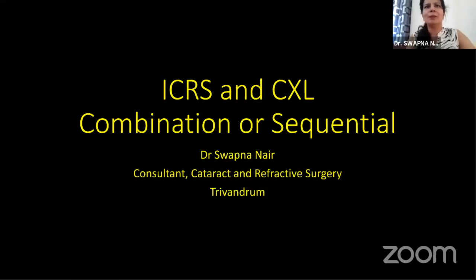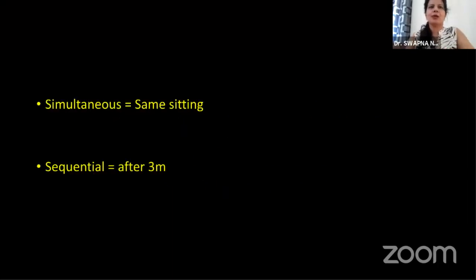I hope my screen is shared. So this has been a long raging debate, and there's nothing new in this particular debate. I'm just weighing the pros and cons of each, what the studies say, and what has been seen over the years. By simultaneous, we mean it happens during the same sitting, that is, you implant the intracorneal ring segment and this is followed by the collagen cross-linking, which can be accelerated or may follow the full Dresden protocol, or it may be epithelium-on cross-linking or epithelium-off cross-linking. Sequential means you do the intracorneal ring segments first and then wait for some time, usually at least 3 months, before you do the second procedure of collagen cross-linking.